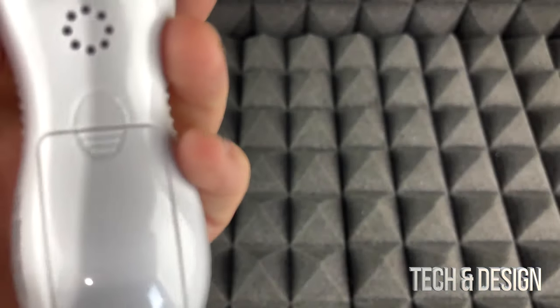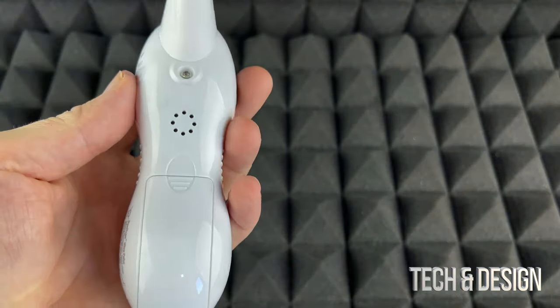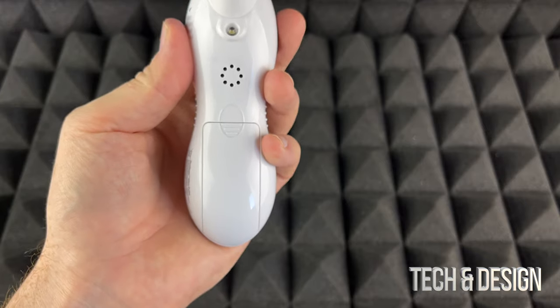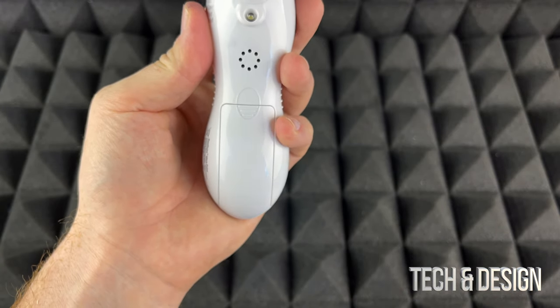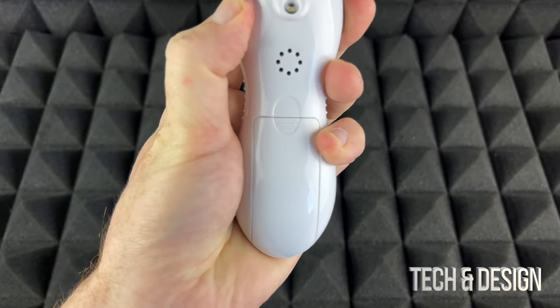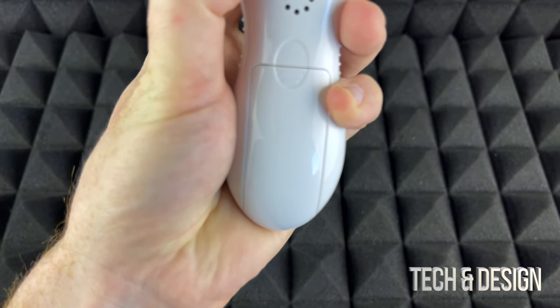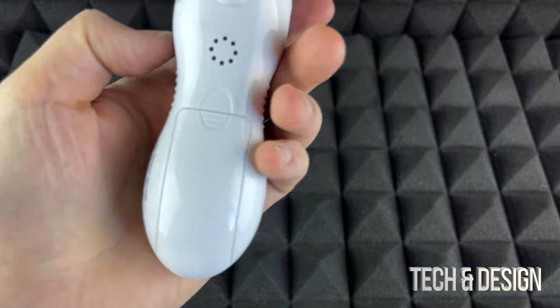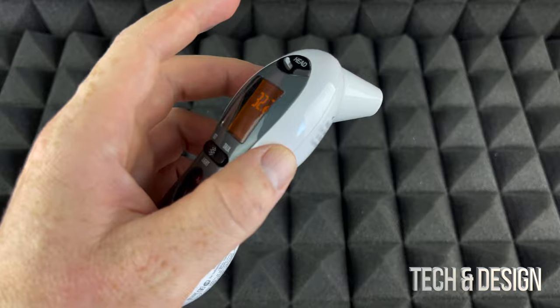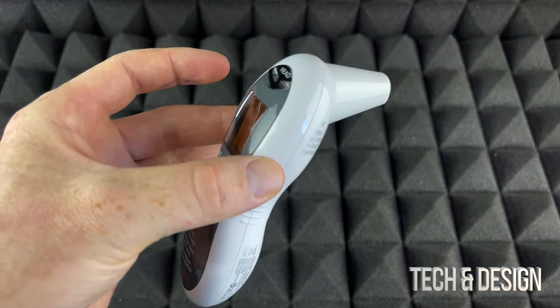I'm going to do that right now. The camera is kind of in the way, but we'll try from far away and see how this works out. Your body temperature is 32.2 degrees Celsius. I just pointed this at my forehead and pressed it — obviously you don't want to be too far away.